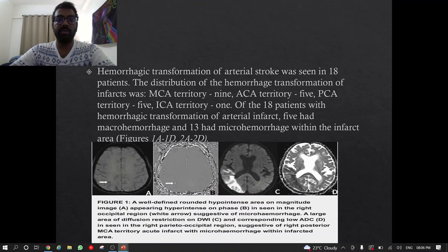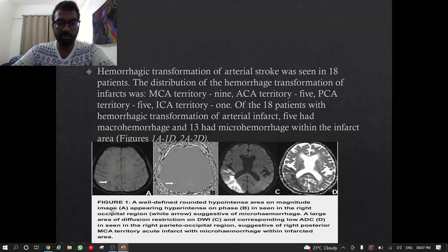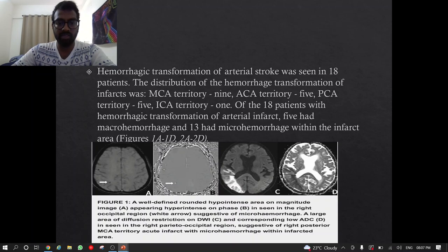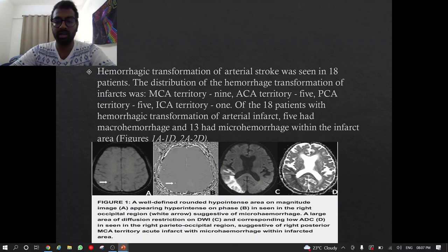Of these 18 patients with hemorrhagic transformation of arterial infarct, 5 had macrohemorrhages and 13 had microhemorrhages within the infarct areas. In the image, you can see a well-defined rounded hypointense area on the magnitude image appearing hyperintense on the phase image in the right occipital region, suggestive of microhemorrhage. A large area of diffusion restriction on DWI and corresponding low ADC value is also seen — this is an MCA territory acute infarct with microhemorrhage within the infarcted area.